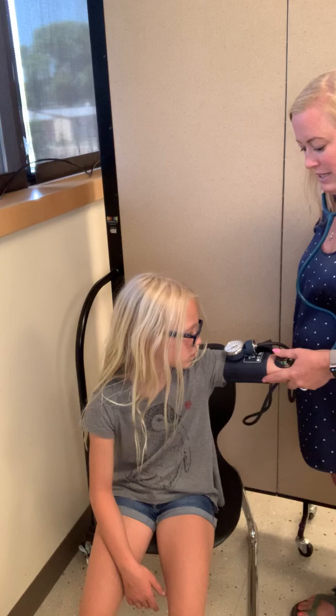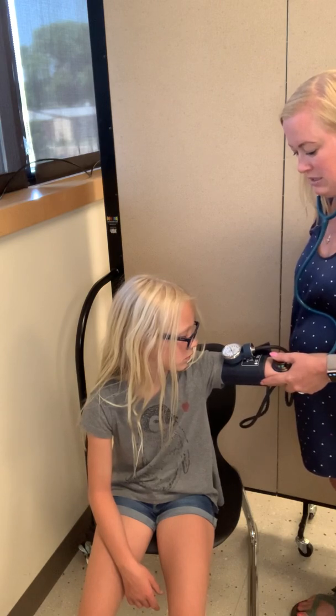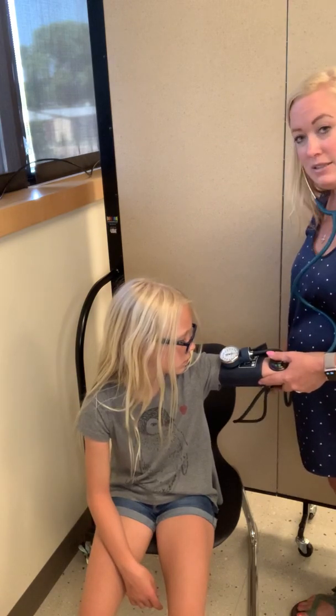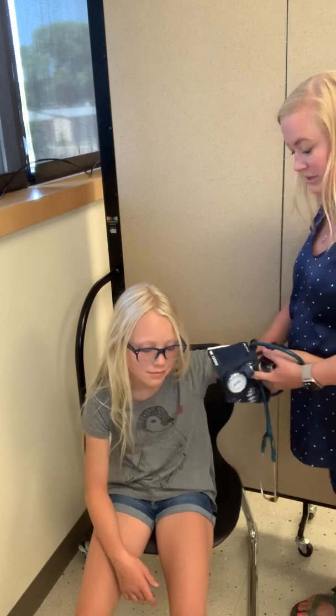And you just let it out slowly. 96 over 50 is her blood pressure, which is very good for a child, and that's pretty typical. How was that, Abby? Fine. So enthused. Thank you for being my volunteer today. You're welcome.